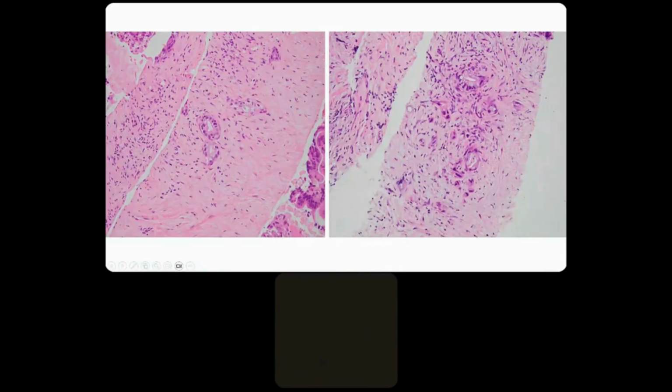And here it is seen in another area. You've got the similar ductular structures with cytoplasmic vacuoles and mucin. And this irregularity, single cells, misformed glands, teardrop-shaped glands, or angulated, sharp-edged glands, single cells, two cells coalescing there, again single cells, that's diagnostic for pancreatic adenocarcinoma. And I'll come back to this particular image later on.